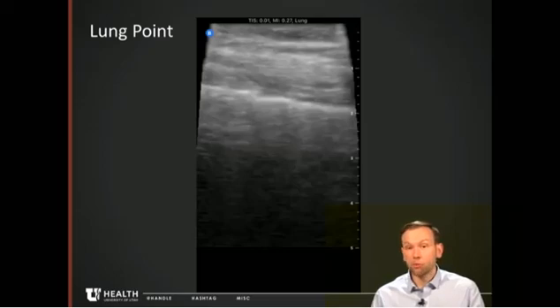And that's extremely important because when you see this finding, you can have absolute confidence that there is truly a pneumothorax, assuming that this is, again, not a capnothorax during a laparoscopic case, and you can put that chest tube in knowing that you're not exposing the patient to an unnecessary procedure.